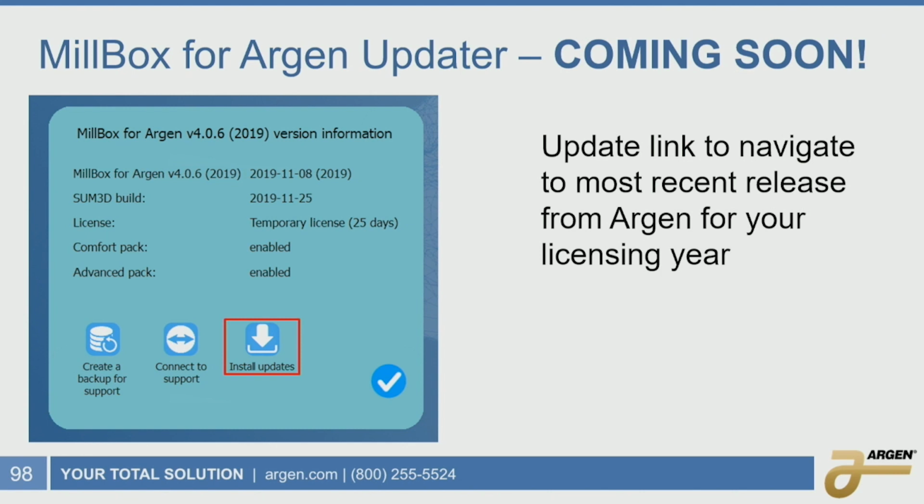Can you talk about the updater? Yeah. So another big topic is always about when to update, how can I update? The process can be somewhat cumbersome sometimes. So one thing that Argen's done now, and this is going to be in one of our future releases, is we're actually going to include an update button. So we'll manage when the updates are pushed out, and we'll mark it and let you know, hey, you can go ahead and upgrade. And you'll just click that little button, and it's going to take you directly to a link to where you can then upgrade your software so that you can do it on either your time or know that you're getting the most recent versions.